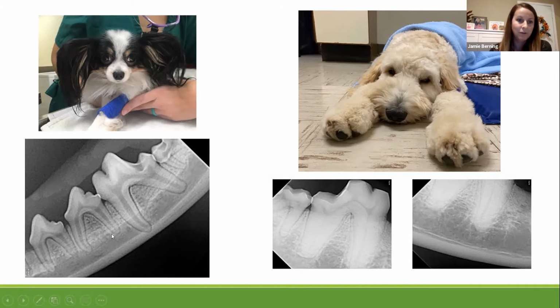So you can see the mandibular canal right here, or you can see it running kind of over here. And I put both of these in here just so you could see we had this as well. But you can tell that we have all four of the positions. So right here would be position 0. We would have a 1, a 2, and then a 3. So no overlap at all right here with that mandibular canal.